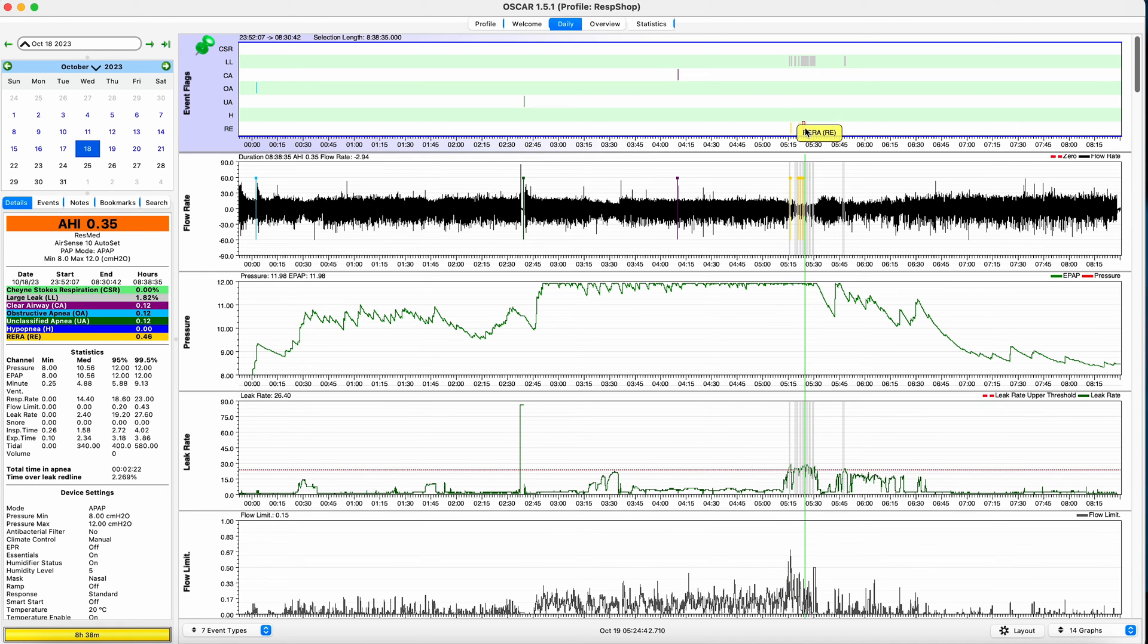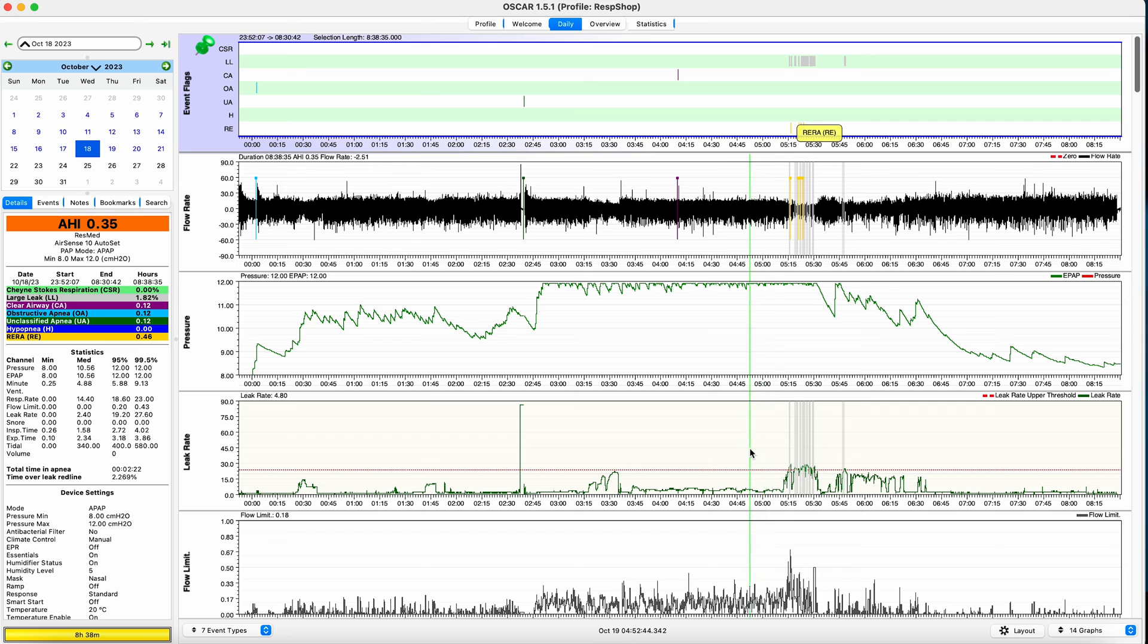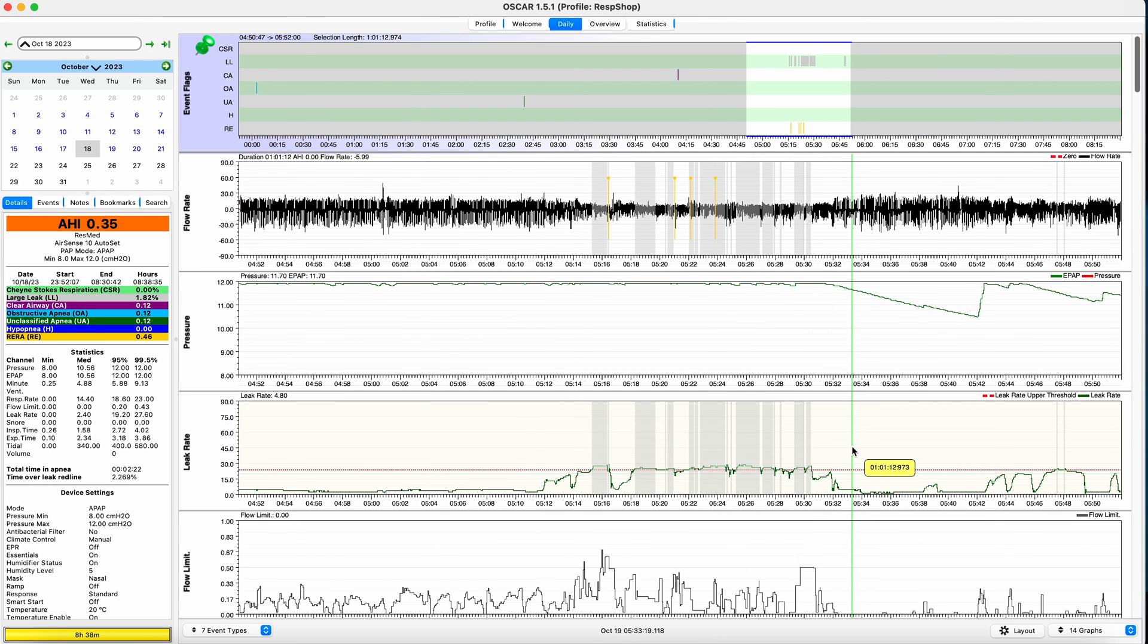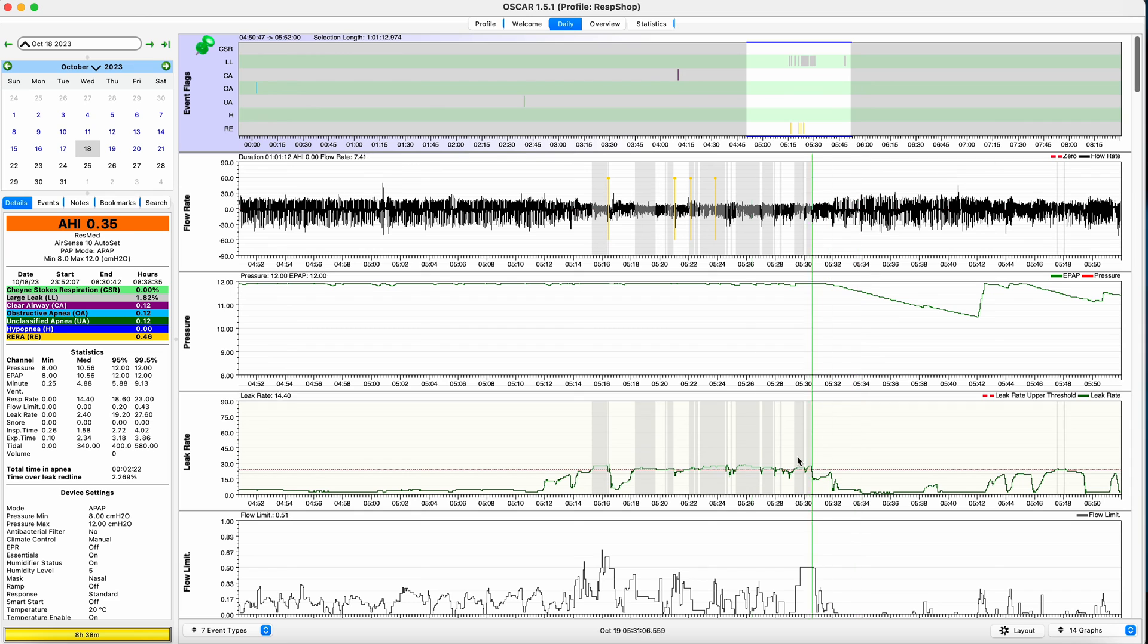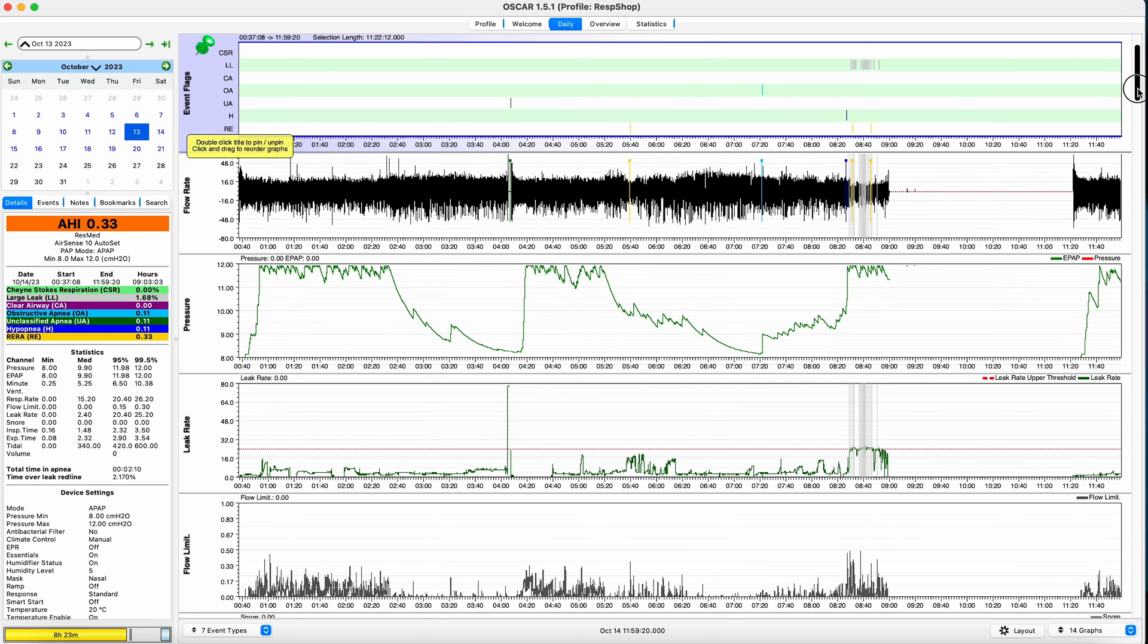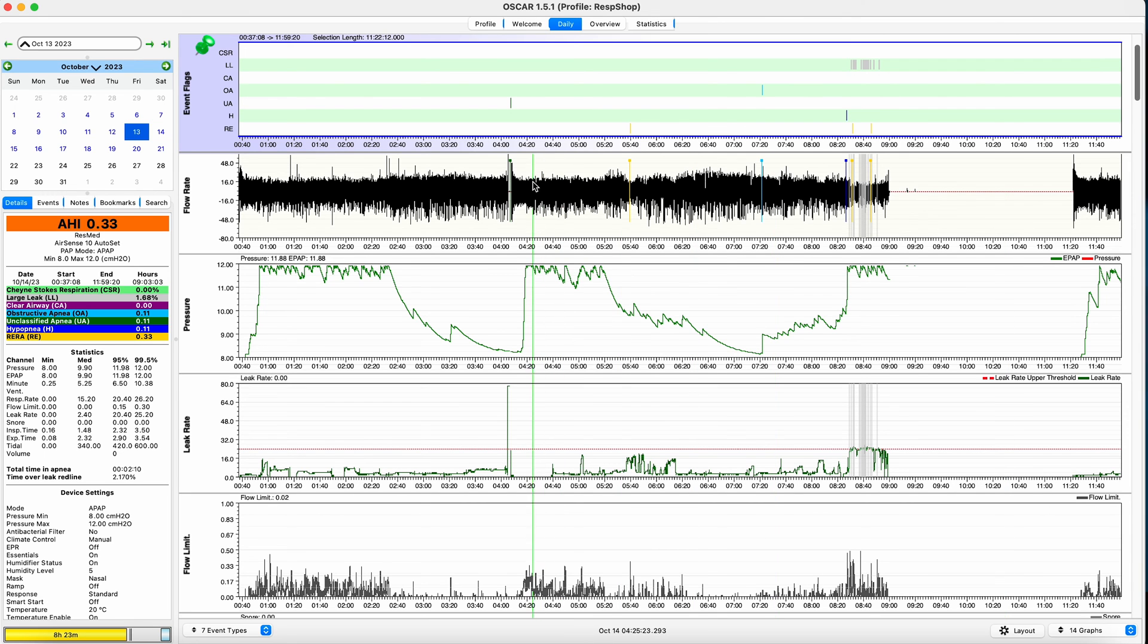For instance, if you have an apnea event flagged, but it doesn't fit a typical apnea pattern with flow restriction occurring in the buildup, it could be that you woke up and resettled for a different reason. If the leak rate went up and if the mask pressure starts fluctuating, it could be a case of mouth leak that caused arousal rather than an actual obstruction of your airway. In such cases, you can dismiss these events. On the flip side, there can be times when the flow rate makes clear that a hypopnea or RERA occurred, but it wasn't flagged. Check out the video in the card and description if you don't know the difference between these events.